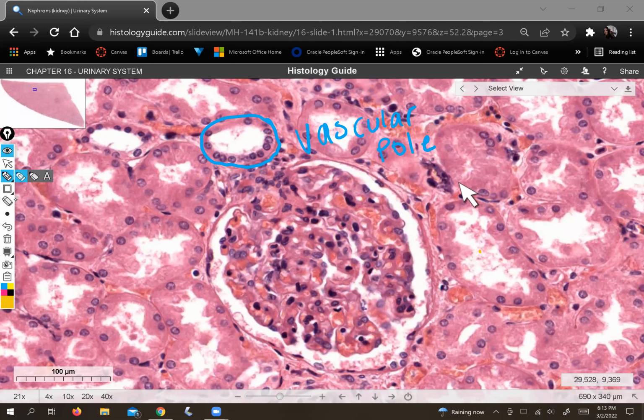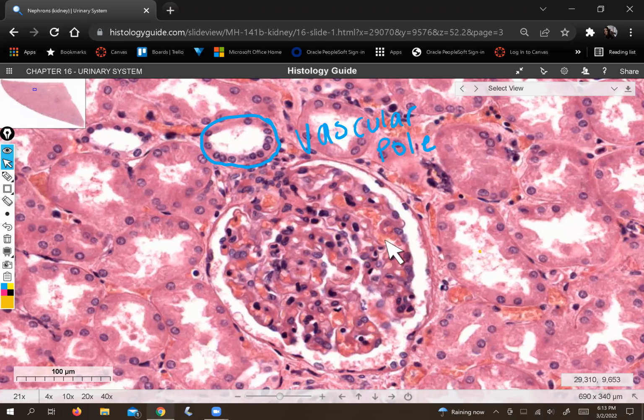So as you can see from this picture, let me just use this guy for a second. So you can obviously see some of the little arterioles of the glomerular capillary. So we can see one. Here's another one. You can see red blood cells here and there giving you little glimpses, but also remember that these are covered over by podocytes. So you're also seeing the nuclei and cytoplasm of a bunch of podocytes in addition to the capillary endothelial cells that are making up the capillary itself.